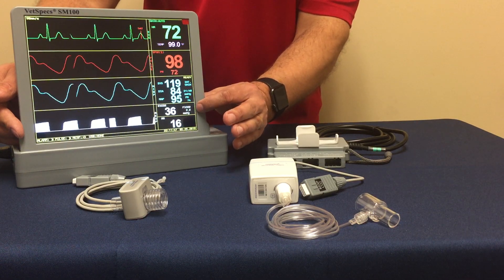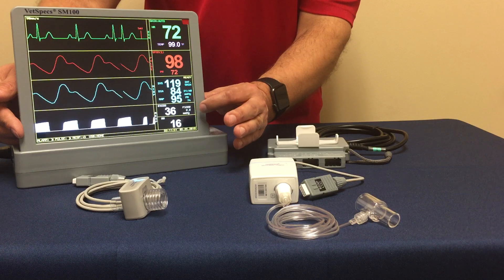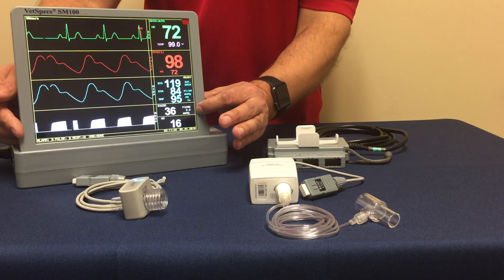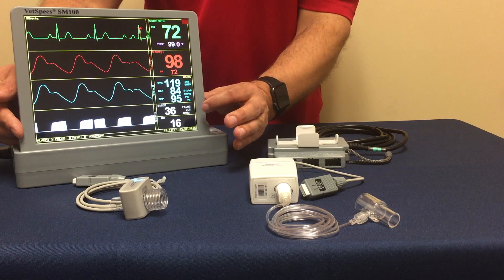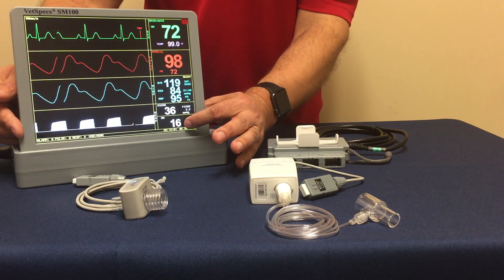We're going to have your end-tidal CO2 value, the larger number showing as 36. There is a fractional-inspired value, which is a bit unique in capnography. Fractional-inspired is essentially the re-breathing of CO2. And then lastly is your respiratory rate.